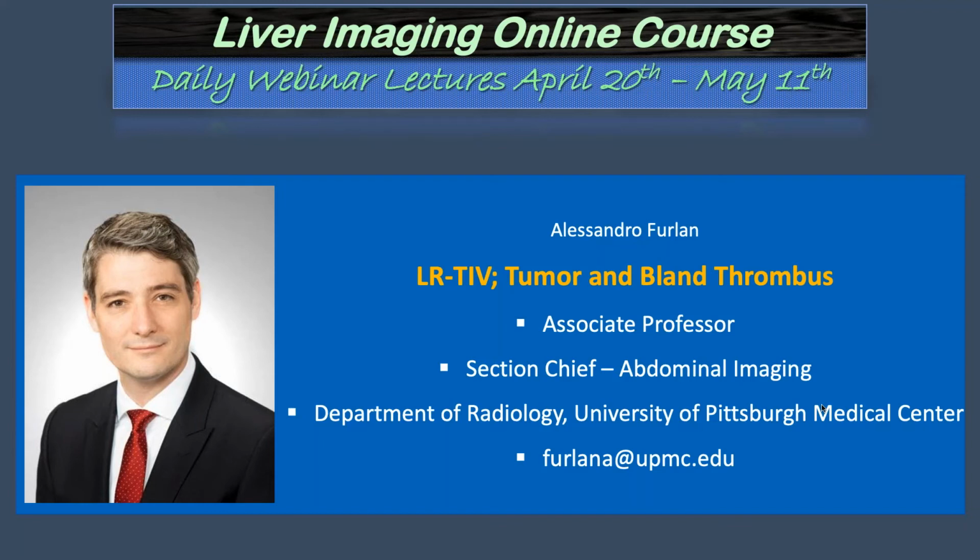So my question is, many times the infiltrative HCCs don't enhance that much, and if you have a tumor thrombus in the portal vein or any vein, how do you deal with that situation? Because if the native tumor is not enhancing, the thrombus is also not enhancing. How do we be more definitive about whether it's a tumor thrombus or a bland thrombus?